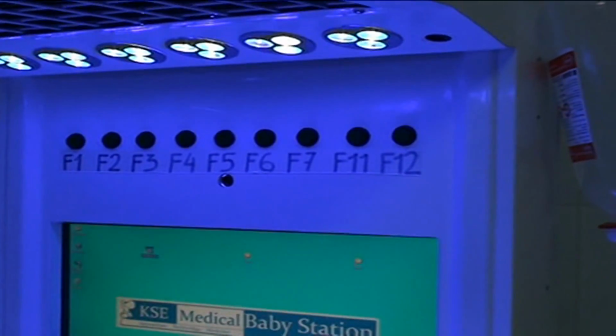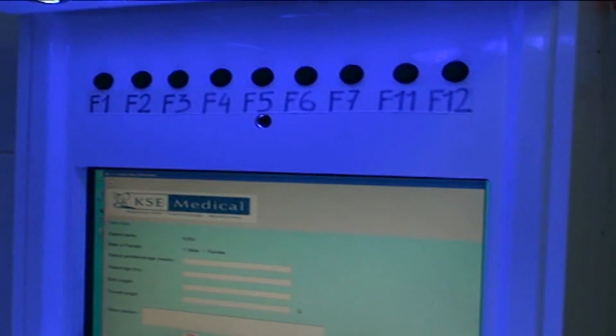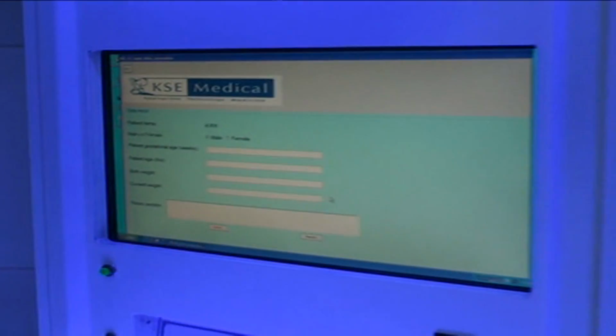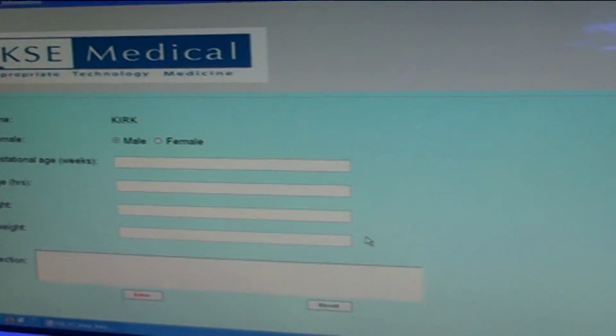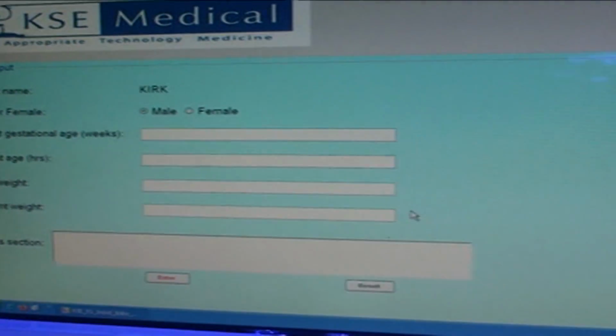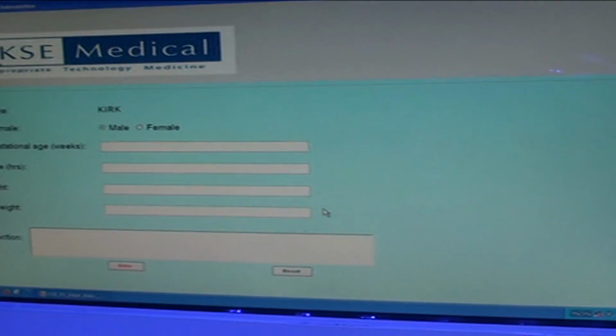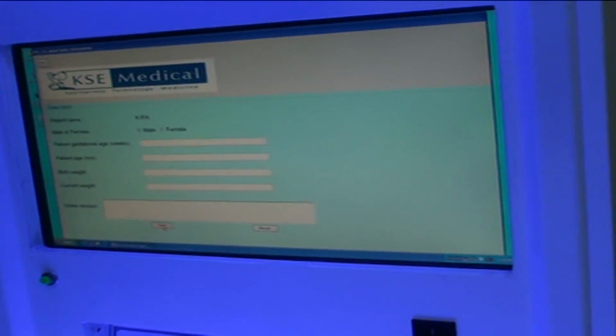When they are done, hooks goes back, and then the doctor has time to let the sensors stabilize, and the doctor can input the other things like the patient age, gestational age, birth weight, etc. This will all be expanded to fit the needs as per our doctors' guidance here, mostly at Vigny in Vietnam.